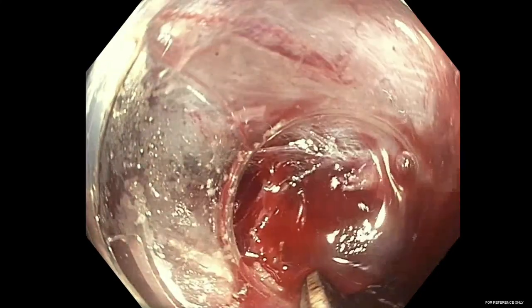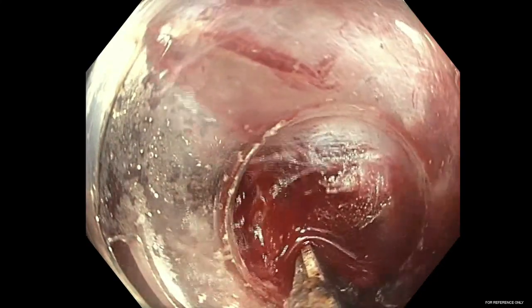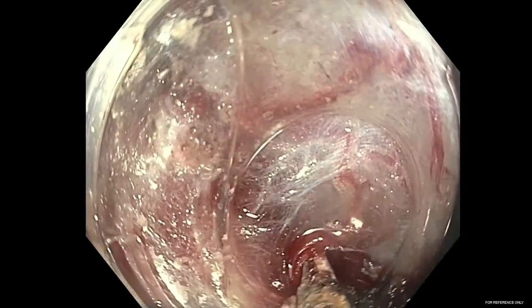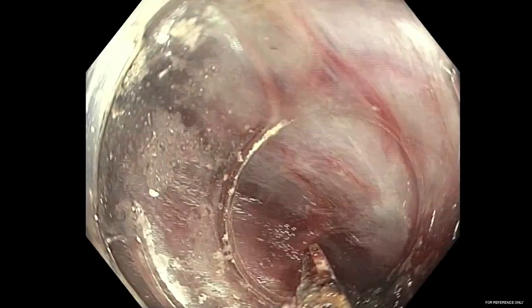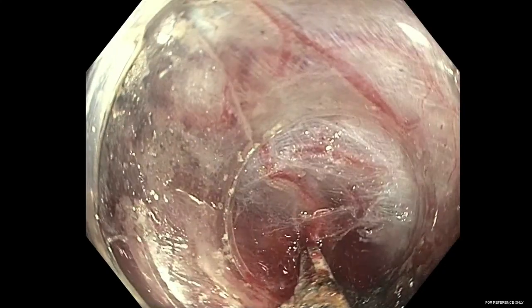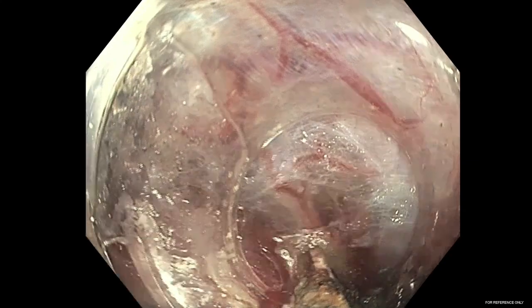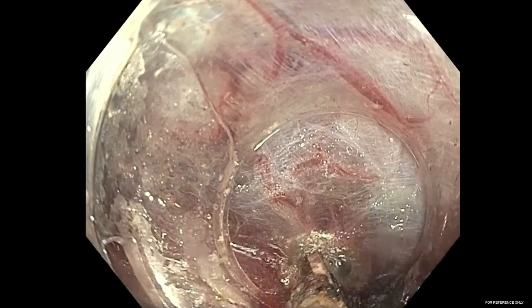Here, we encounter active bleeding at which time hemostasis is achieved. It is important to note that the bleeding point can be coagulated from both sides of the device given the microwave field. This is nicely demonstrated here, as 10-watt microwave coagulation is performed for periprocedural bleeding during this rectal ESD.